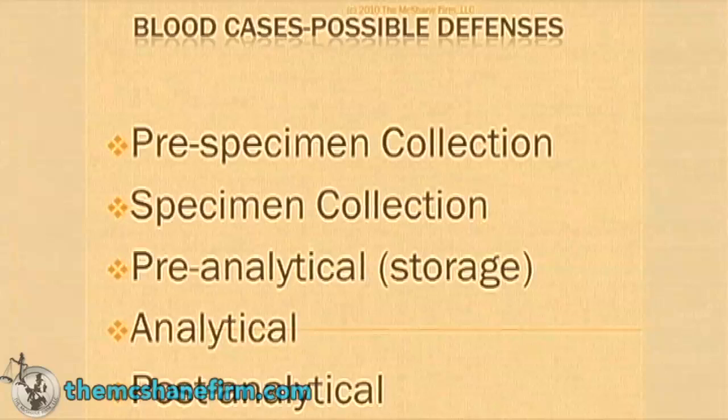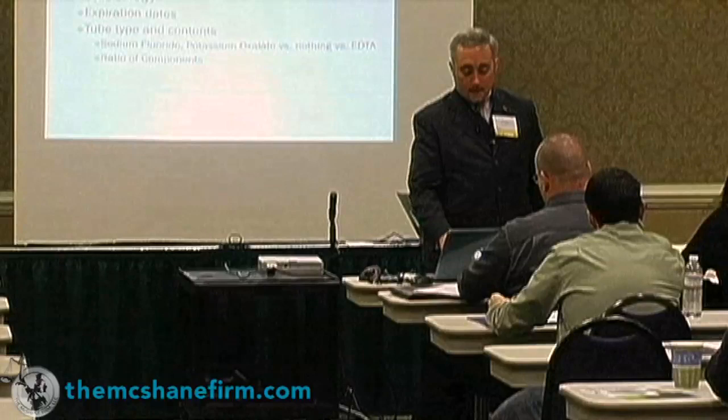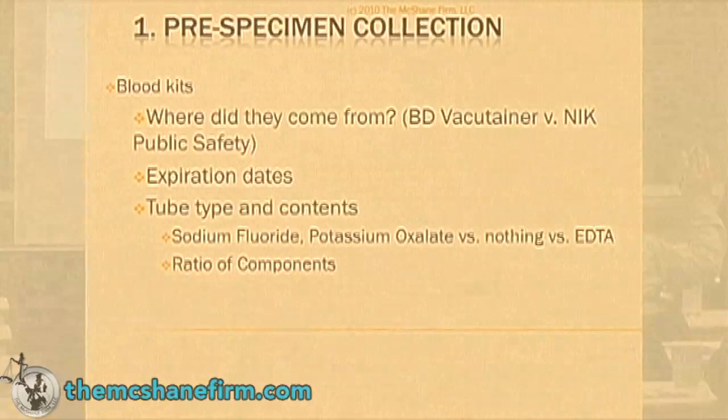Pre-specimen collection, pre-analytical, meaning storage, analytical, post-analytical. Okay, drawing your attention to this and some highlights that are here. Pre-specimen collection. Okay, where did the kits come from? How many people have actually seen blood kits and blood tubes? Raise your hand. Okay, great. So you guys are familiar with this stuff.